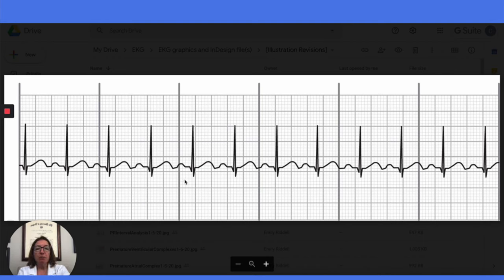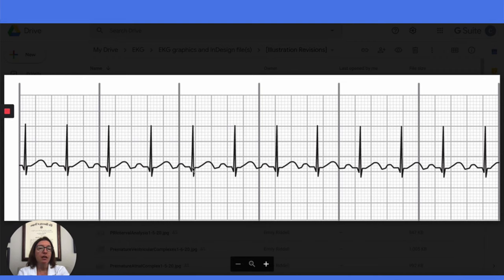The other components of the strip are normal — our P-waves are nice and upright, our PR interval is normal, our QRS complex is nice and narrow, and we have a QRS complex for every P-wave. So this is also a sinus rhythm, but because the heart rate is over 100, it is sinus tachycardia.